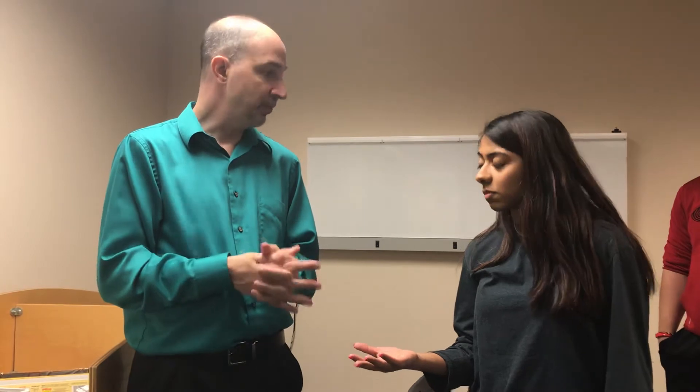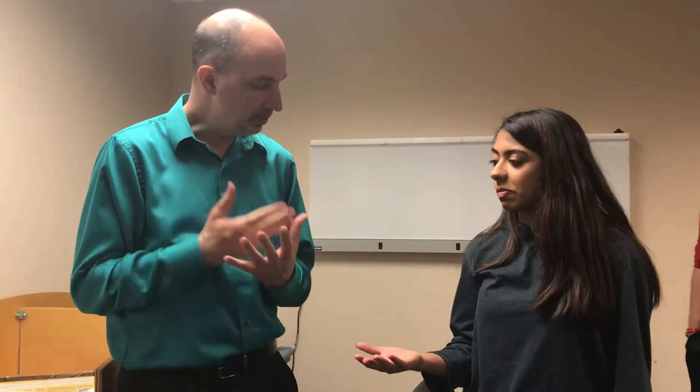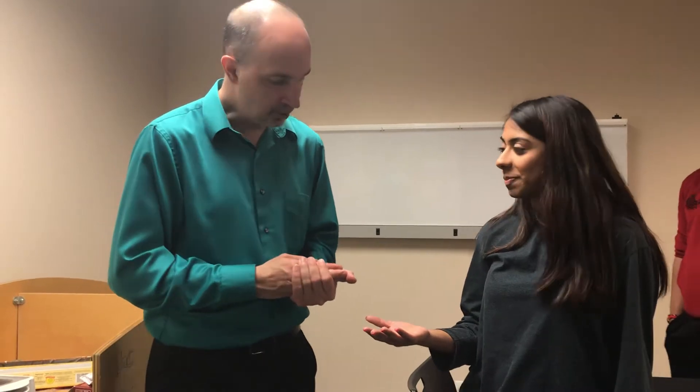So I checked sensation, I looked at the skin, I explained the indications. We're going to do this because you have pain throughout your hand and your joints because of rheumatoid arthritis. There's inflammation in the joints and that can lead to pain — paraffin is a very nice pain management strategy for this. We'll try this in clinic to see if you like it, and then we'll talk about some websites where you could consider ordering something for home use.